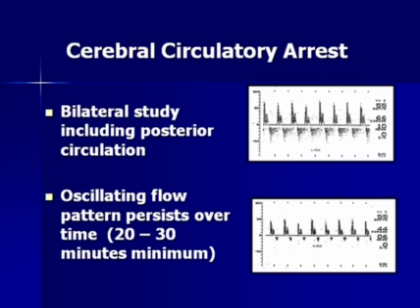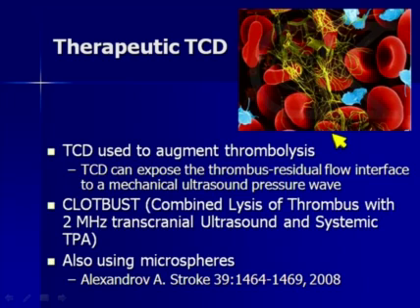And we can see these transcranial Doppler signals showing very high resistance flow, pretty much no flow through diastole. And we would check and make sure that this sort of oscillatory pattern persists for several minutes, usually up to at least a half an hour. And this is just not enough circulation getting in to that tissue, and again, associated with brain death.